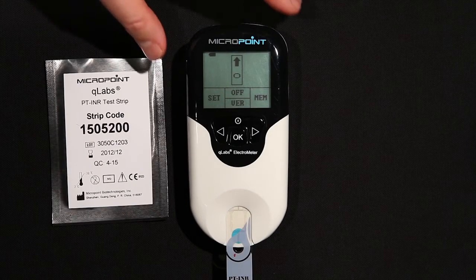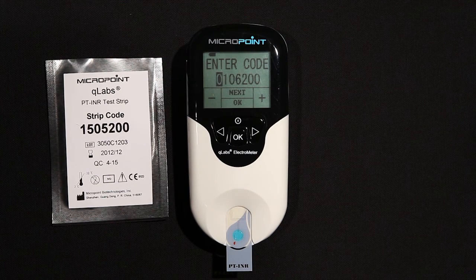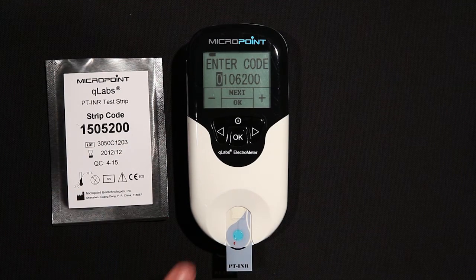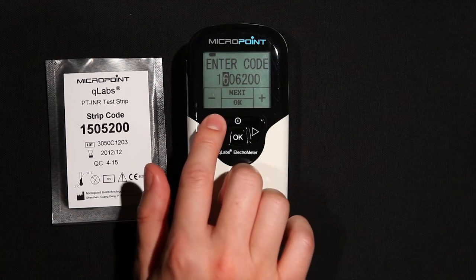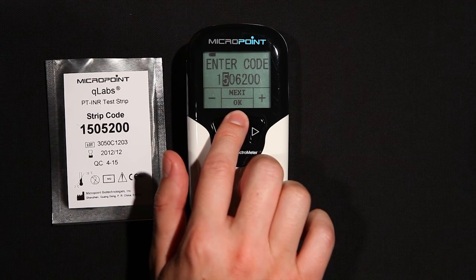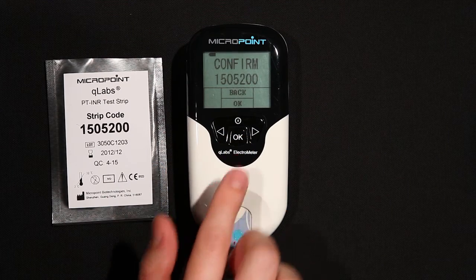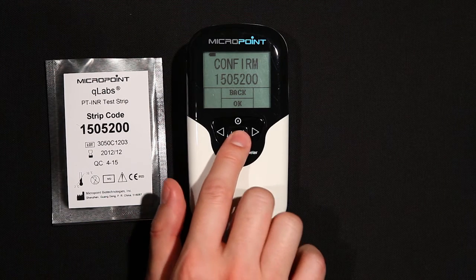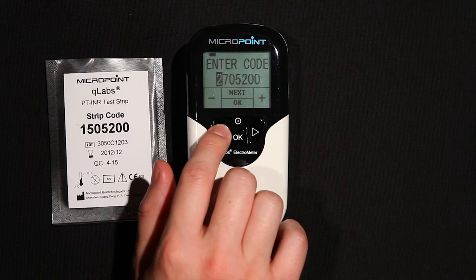When the test strip is properly inserted into the Q-Labs Electrometer, the display will prompt the user to enter a 7-digit strip code, which can be found on the pouch of the test strip. Use the plus and minus or right and left buttons to increase or decrease the value of the highlighted field. Press Next to select the next changeable field, and press OK to accept settings. The next screen will ask to confirm the strip code entered. If correct, press OK. If not, press the back button to return to the previous screen and make the necessary changes.